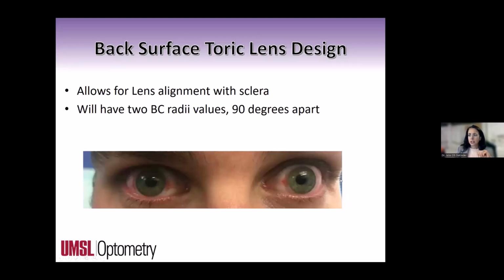When you look at this patient here, they walked in and they said, hey, I think there's something wrong with my lenses, Dr. DeKinder. And from across the exam lane, I said, oh yeah, clearly I don't have your periphery adjusted right on those. They're landing way too hard horizontally. And that's why you can see this injection here. So if I see this, and I see it when I'm talking to them outside the slit lamp, and then I look in, I can almost tell you beforehand that what I'm going to see is that this is not necessarily too tight, but this vertical is definitely not tight enough.